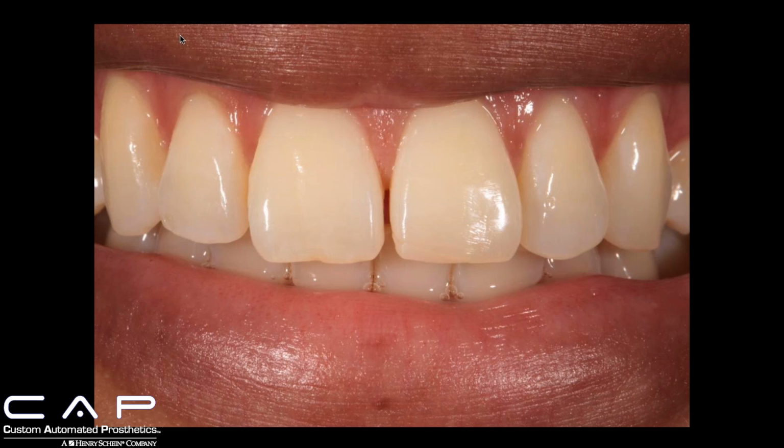And so what I'm currently doing for myself is putting together a checklist of everything that I need for each patient that I see, and I think that's a really good idea for all of you guys as well. Have it hanging up in your lab wherever you do your custom shades, and so you can go through that list and get every angle and every photograph that you need before you send the patient home.